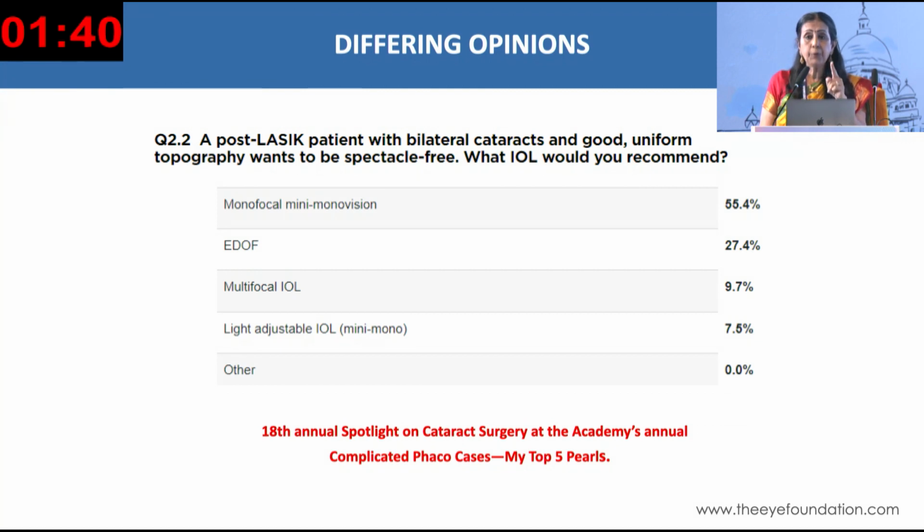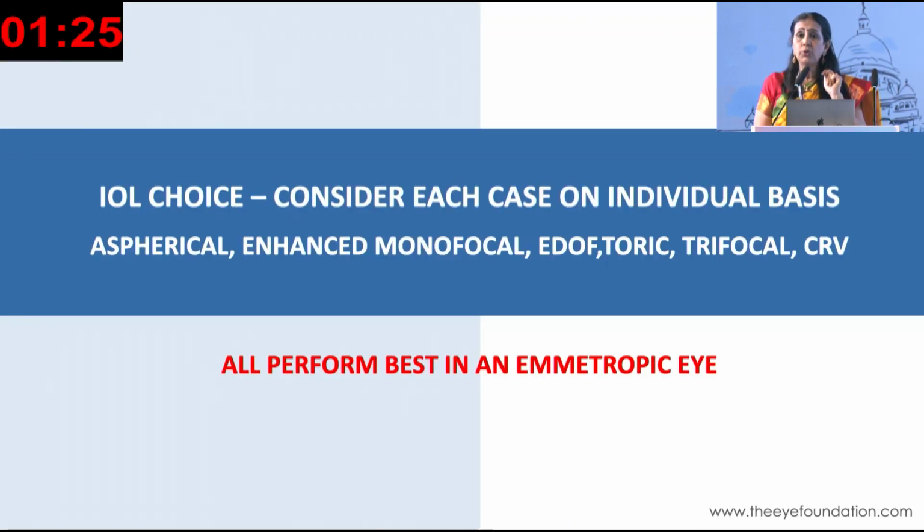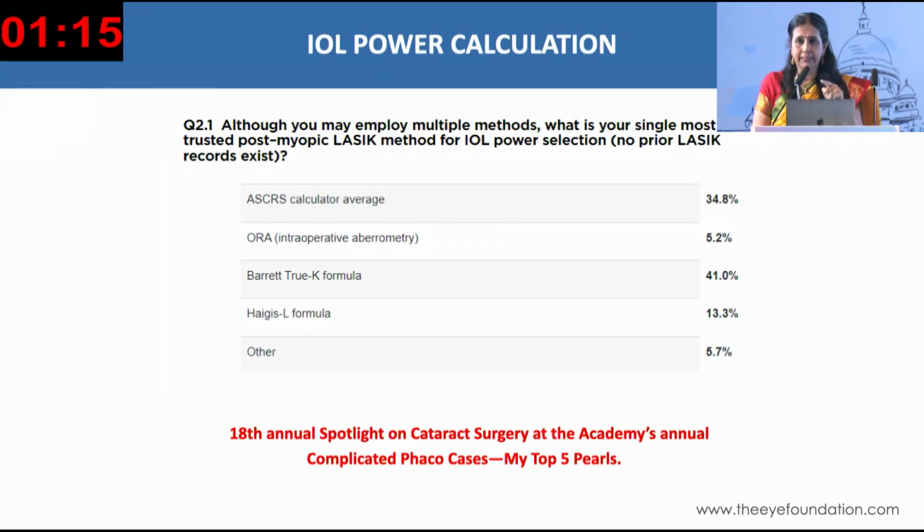If it is a hyperope patient, you could put an EDOF, you could put a monofocal, but you could also put a multifocal if it is not a very high hyperope, because the central cornea is not very much affected in a hyperopic ablation. So we also know that all these lenses, aspheric, enhanced monofocal, EDOF, everything does very well in an emmetropic eye. But how do they do in a post-LASIK eye? And what would be the IOL formula which you would use?